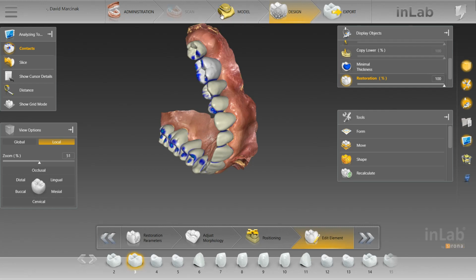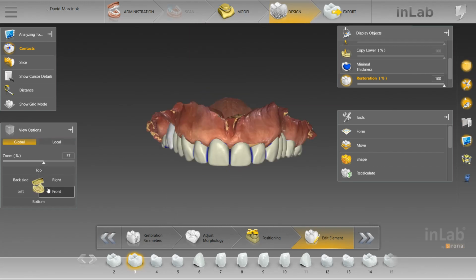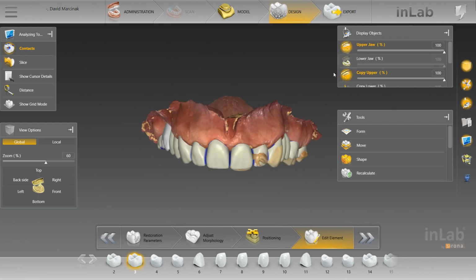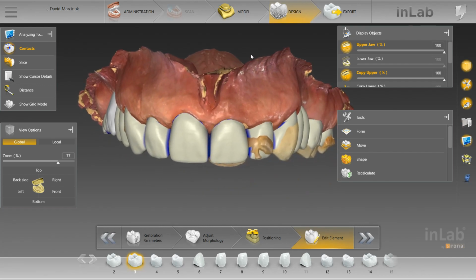But as I was saying, in the model phase, when you set the model axis, you can go to this feature right here, view options, and have a consistent view of the front. And then also, when you overlay the biocopy scan, you can see how things were diagonal before. And we've leveled it all out. Diagonal, leveled it out. Diagonal, leveled it out.